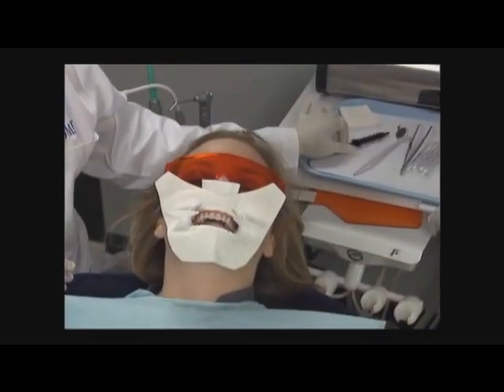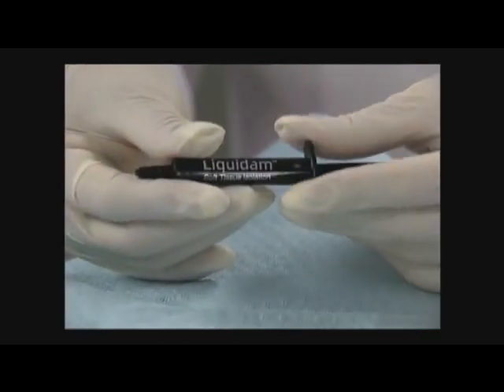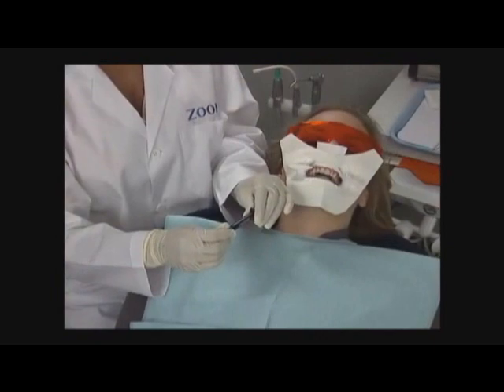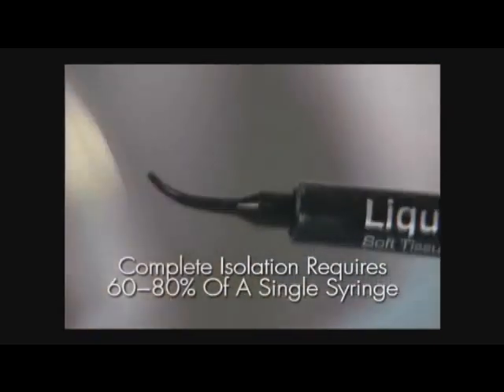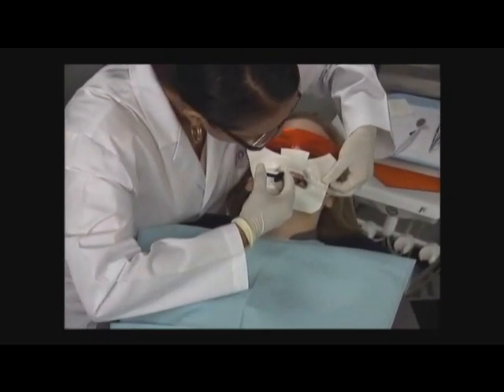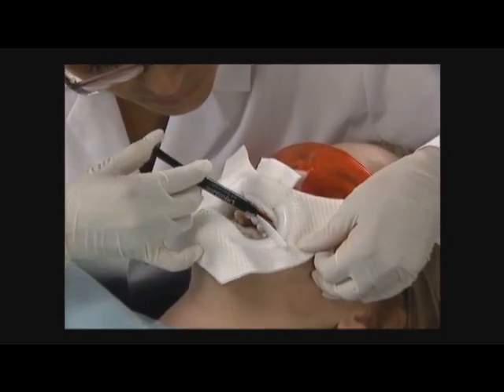Remove the cap and attach the tip to the Liquidam syringe. Be sure the tip is inserted fully into the recessed area of the barrel and lock it into place. A complete isolation requires 60 to 80% of a single syringe. Do not apply Liquidam more than 2 millimeters thick, or it may not cure completely.